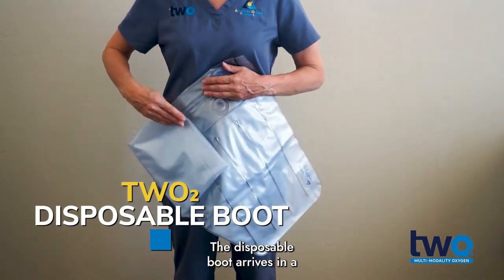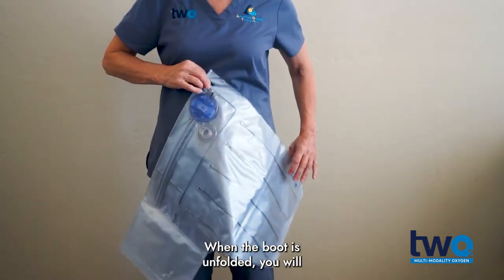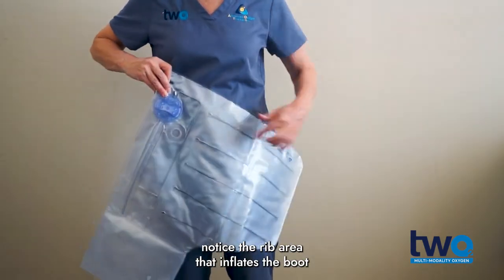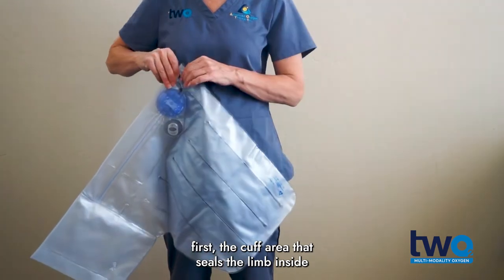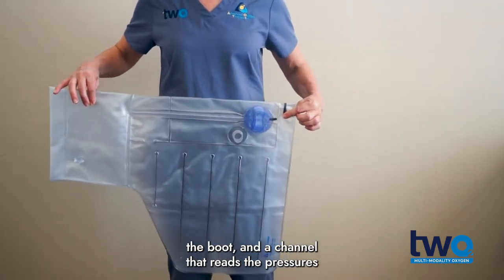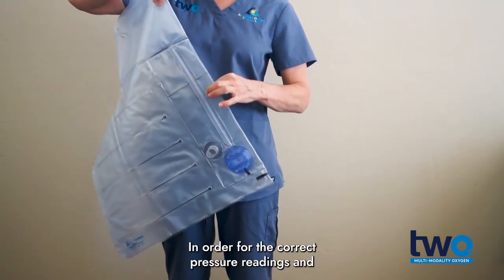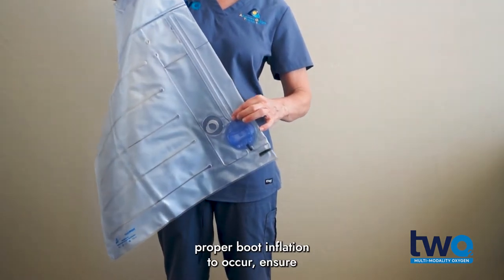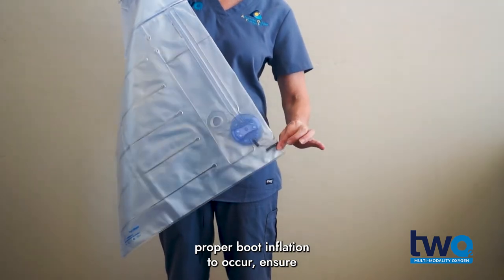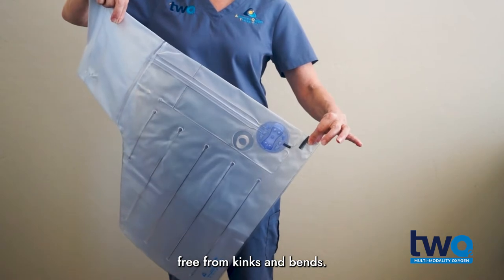The disposable boot arrives in a box of 20 units. When the boot is unfolded, you will notice the rib area that inflates the boot first, the cuff area that seals the limb inside the boot, and a channel that reads the pressures within the cuff. In order for the correct pressure readings and proper boot inflation to occur, ensure the channel and the reinforced tab are kept free from kinks and bends.